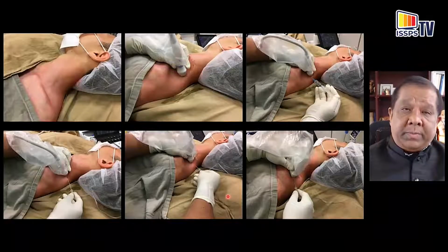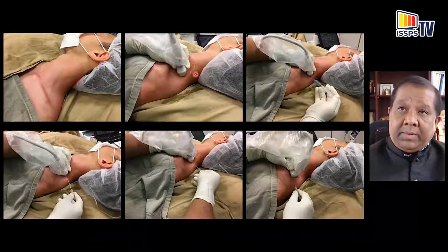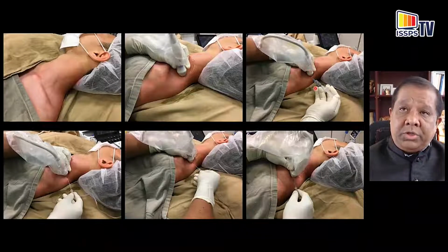This is from another perspective. You can see the patient is lying supine with the head turned to the contralateral side under strict aseptic precautions. A high-frequency linear transducer is being used to produce a transverse oblique scan of the brachial plexus. Once the target ultrasound window is achieved, under local infiltration, the needle is introduced to perform a periplexus injection of the superior trunk.